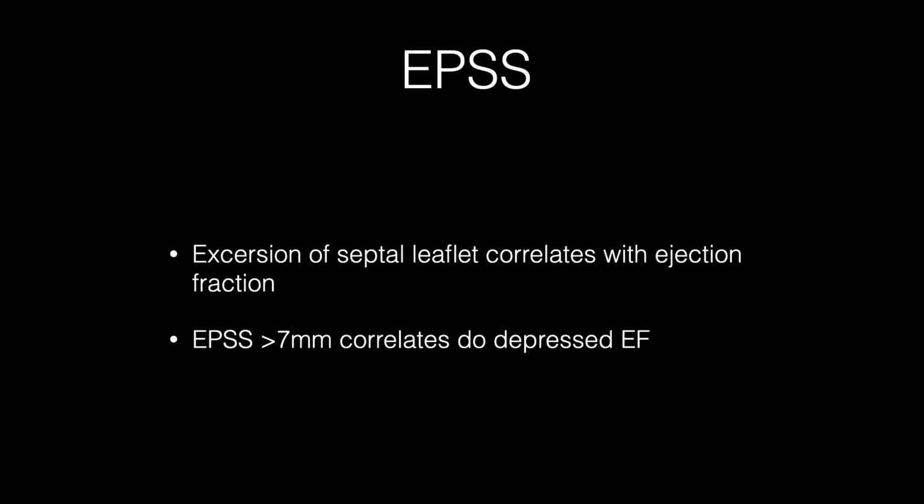You can certainly be reasonable in your assessment on a gestalt, but it's certainly helpful to have some tools from time to time to add to our gestalt so that we can really check our work and clarify that this is, in fact, a reduced ejection fraction. So I like to use the EPSS as a way of checking that, because it's not too terribly difficult, and it gives you some numbers that you can rely on.